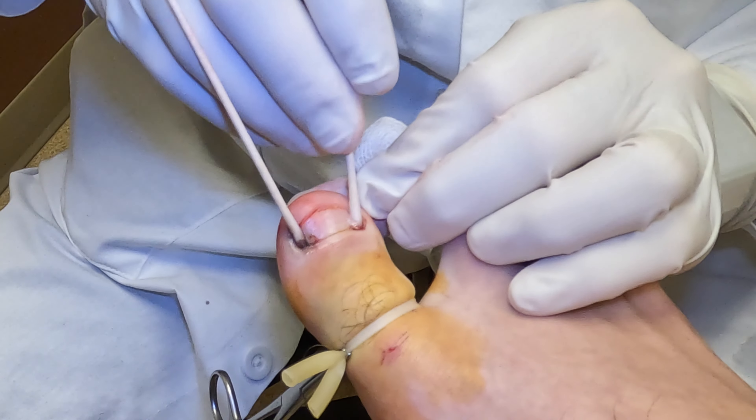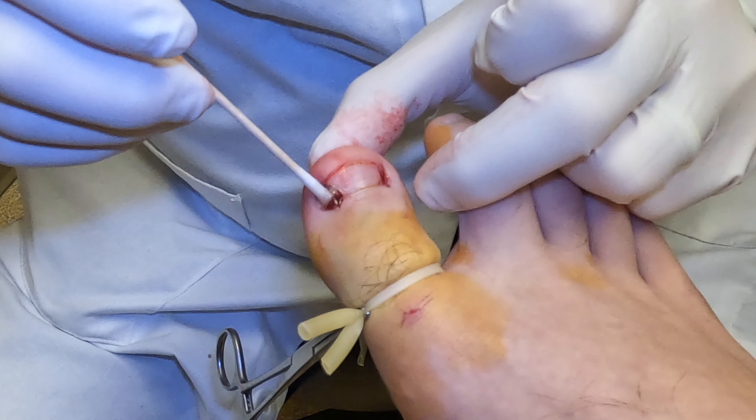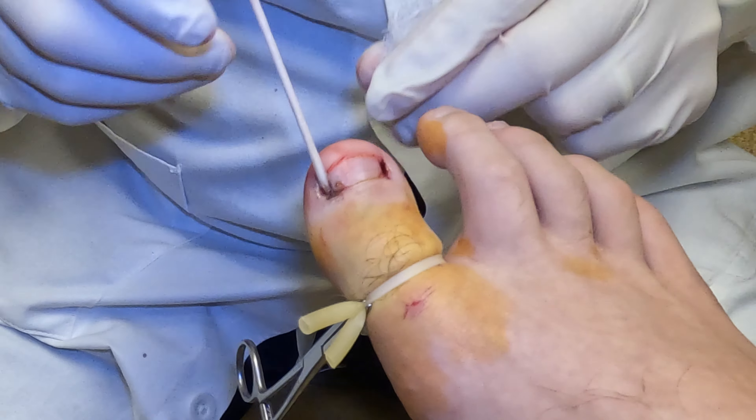After that's done, the next step is to put the chemical in. It's a chemical called phenol, and this creates a chemical burn that stops the nail plate from growing back. We do three applications of this — they're 30 seconds each — and that stops the nail from coming back.